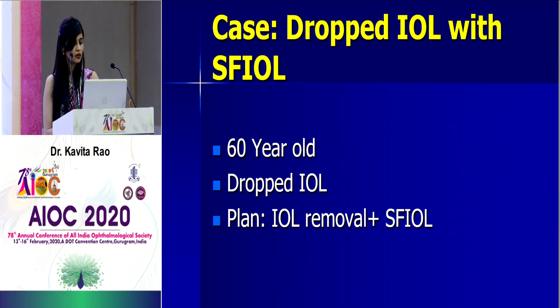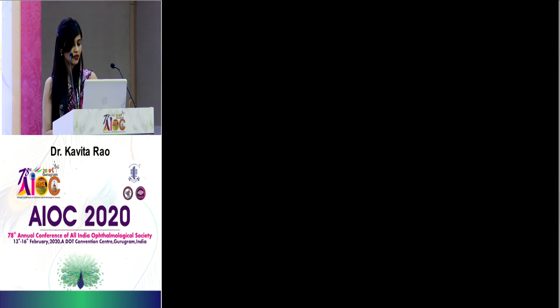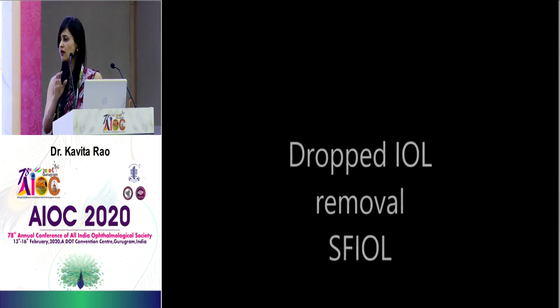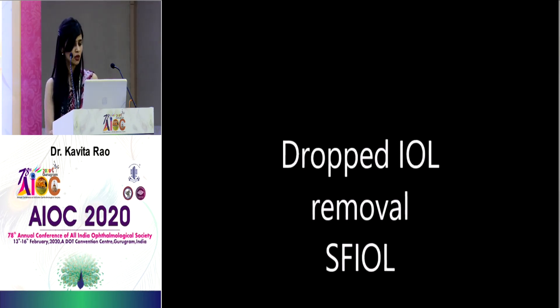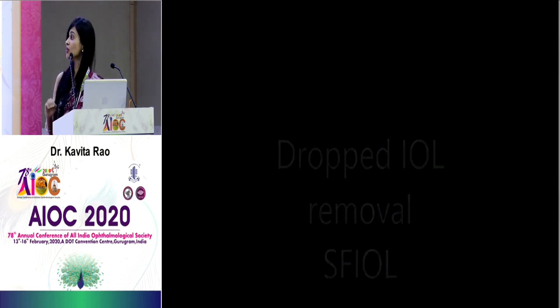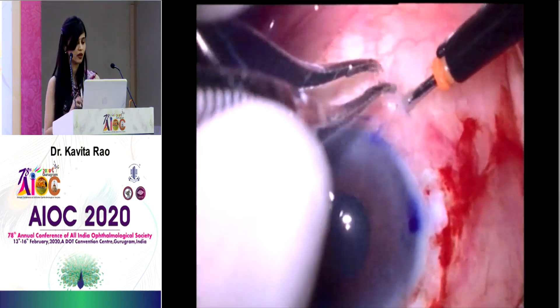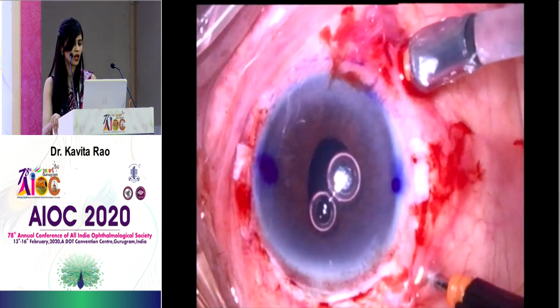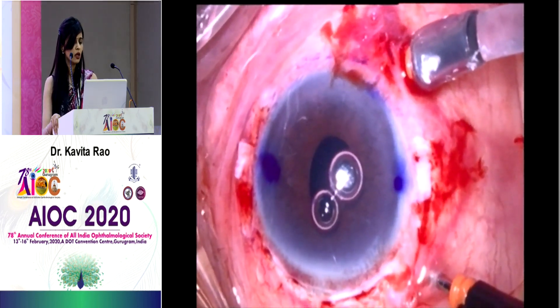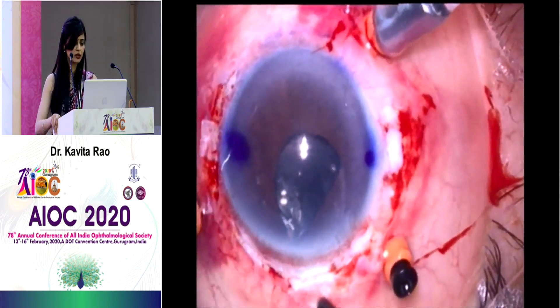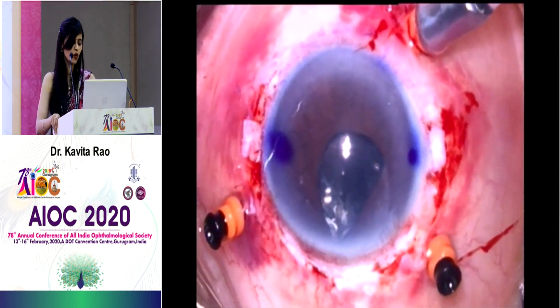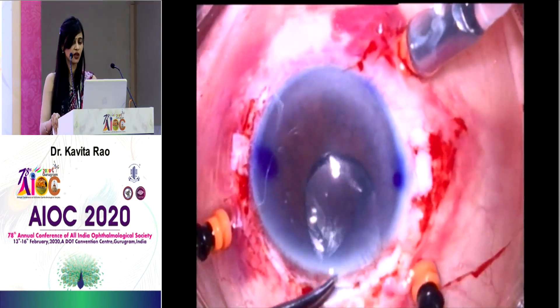The next case is another dropped IOL, again planned as an SFIOL. The IOL was grasped and removed, and I performed a four-point fixation SFIOL. For those doing planned SFIOL without three vitrectomy ports, a tip would be to use an anterior chamber maintainer so you don't constantly need to add viscoelastic.